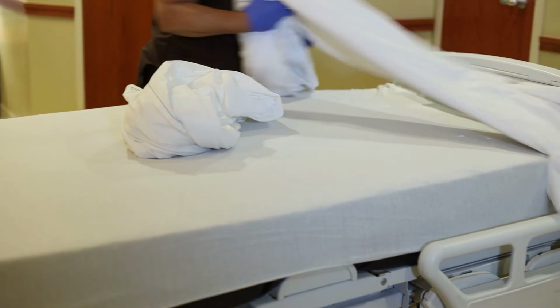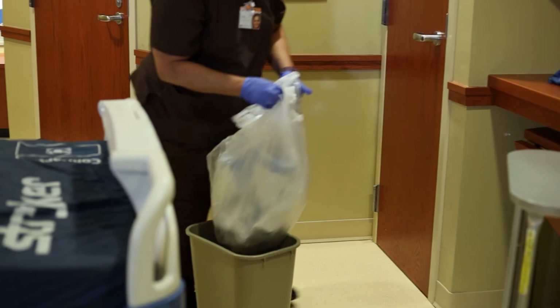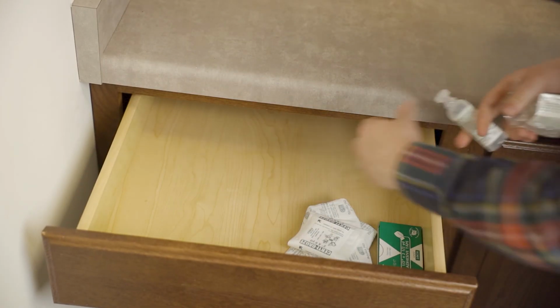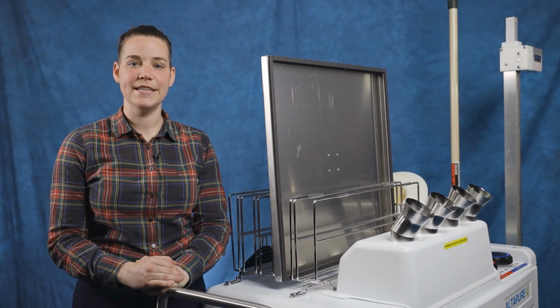To ensure Altapure works most effectively, before starting the cycle, strip the bed of linens and prop the mattress up. Remove the trash bags from the bins. Open the drawers you wish to have disinfected, and open up the recliners. Remove any sterile packaged items or put them in a closed drawer or cabinet. Lastly, should a curtain not be visibly soiled, open it up completely so that the Altapure system can disinfect it.